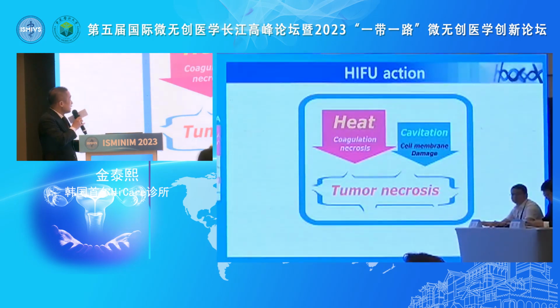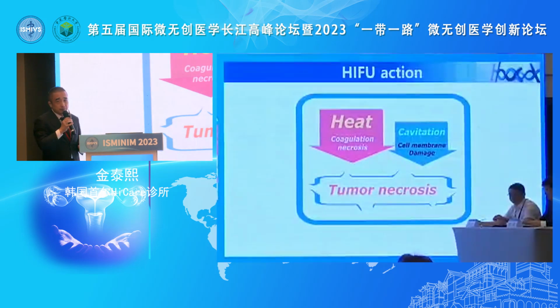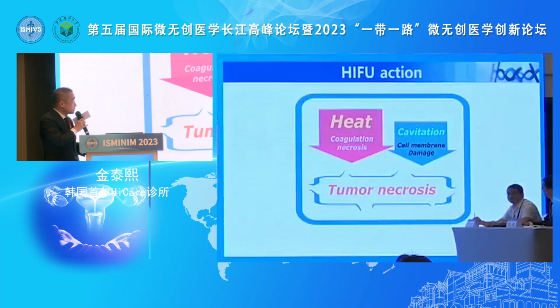Think about the HIFU action. First is heat. This heat makes coagulation necrosis and cavitation. Cavitation makes cell membrane damage, and in this presentation, we want to focus on the cavitation effect.